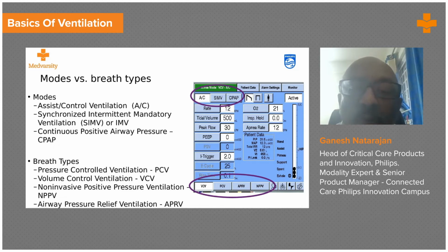Is it a volume breath? Is it a pressure breath? Is it an invasive breath or is it a non-invasive breath? So very simply put, the modes are how you deliver the breath to the patient. The breath type is, do you use volume to drive? Do you use pressure to drive? Do you use a mix to drive, or do you drive it non-invasively?